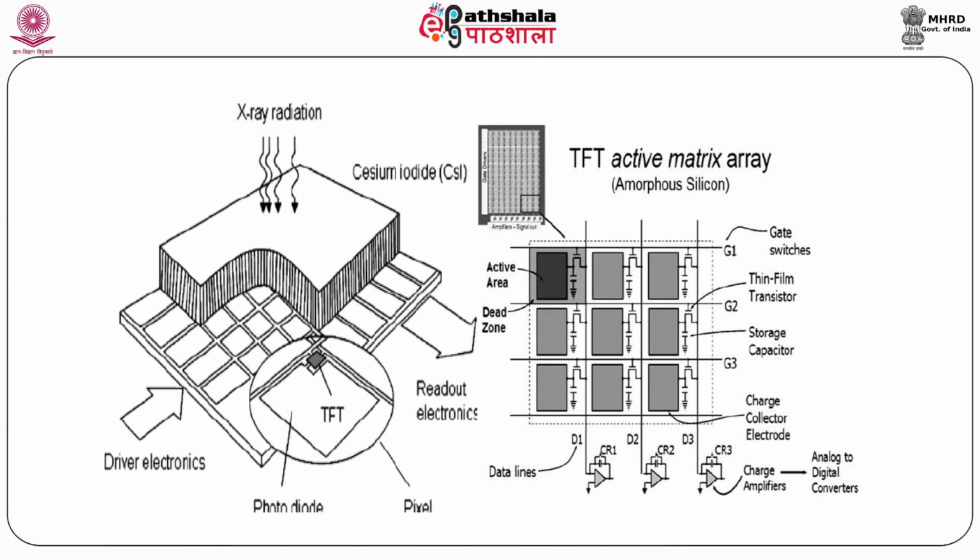So, this area is not utilized in converting light signal into electrical signal, as in the case of either a charge coupled detector or a TFT. In both the detector technologies.